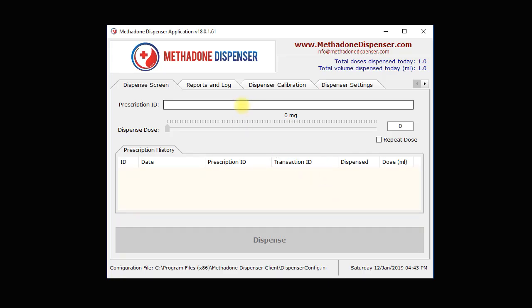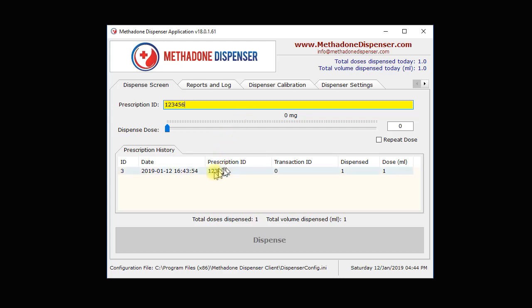If you wanted to confirm whether the dispensing log has been captured, I'll just enter the prescription number. As you can see, as I'm typing it, it is auto-generating an audit log of everything that starts with these numbers, the transaction number, if you will, or prescription number.